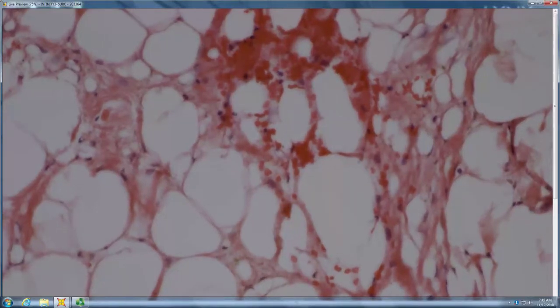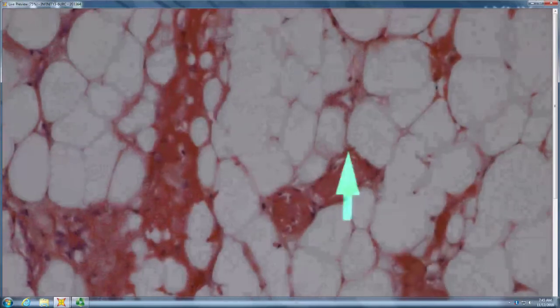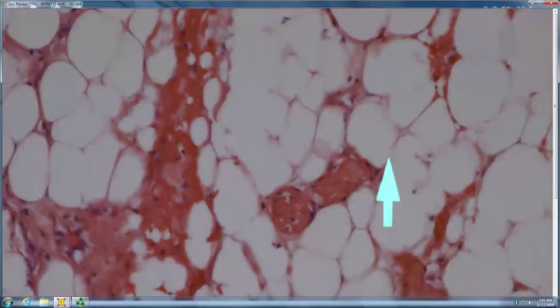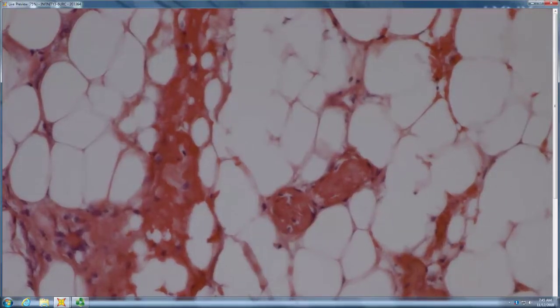So what would you be looking for in these vessels in addition to thrombi? Looking for some calcium deposits. Yeah, exactly. So all of these have thrombi, and then out in the vessel wall, you've got a little basophilic stippling. It would really be brought out with a von Kossa stain. So you're thinking, oh, calciphylaxis.